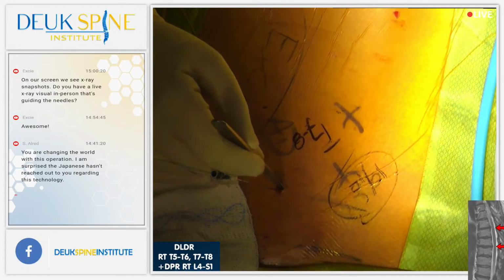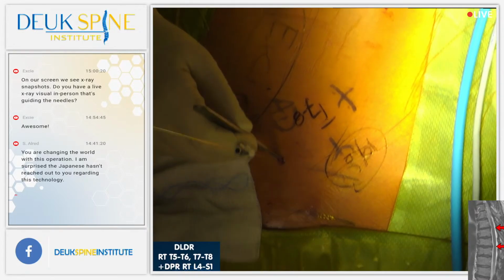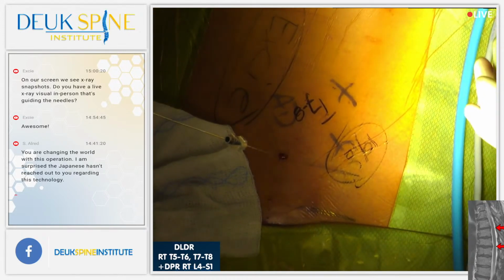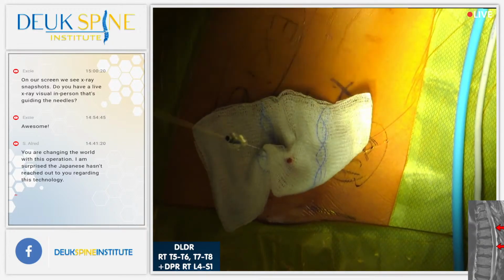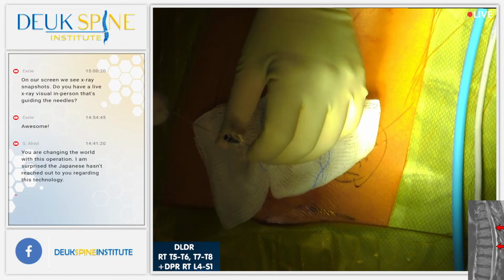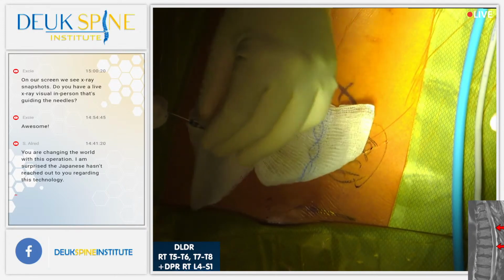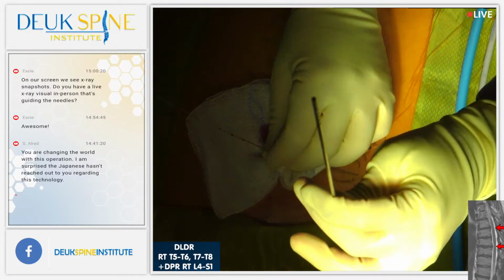This is a stab incision we call for endoscopic surgery. Right along where the tube is going to go down along the guide wire. And you can see from the lateral x-ray shot, she has the guide wire in the disc where the discogram was done. You can see the dark dye in the disc.